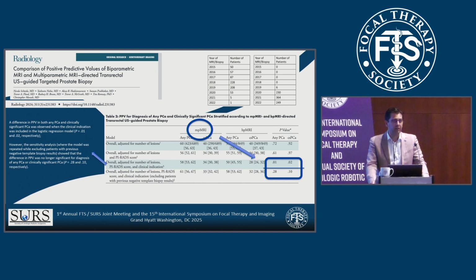However, for focal therapy, I believe the DCE is an important sequence, and Sangeet measured the PROMIS data. If Dr. Emberton's here, he's like, we showed equivalence, but we're not going to give up the DCE. It's very useful to predict what's going to happen after focal, because if you don't have a baseline contrast-enhanced MRI, you're not going to be able to determine if there's residual enhancement of the lesion at the margins if you undertreat it or not. So it's important to make that point.